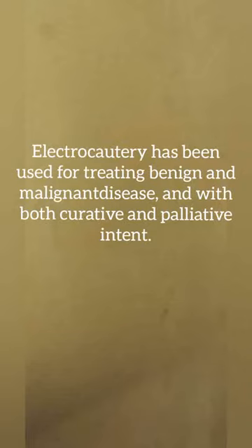This lecture will be about argon plasma coagulation in bronchoscopy. But first, let me revise the last talk about contact electrocautery. As I said, it is of two types, monopolar and bipolar.